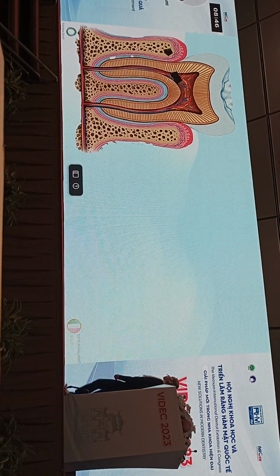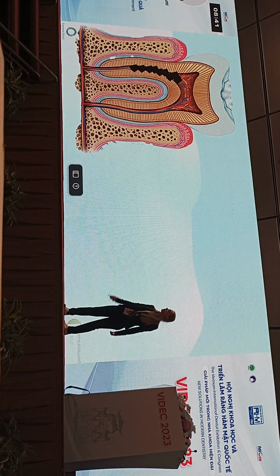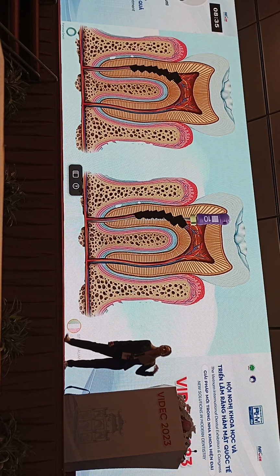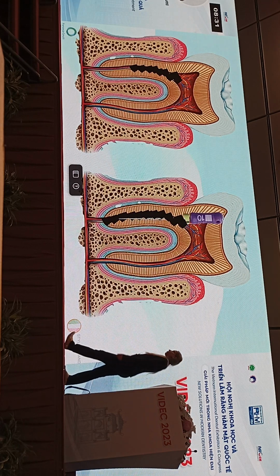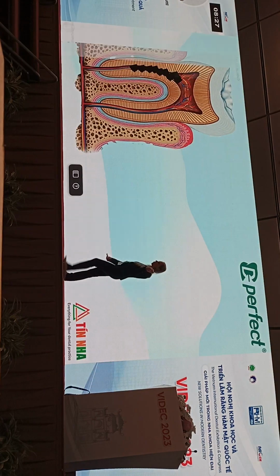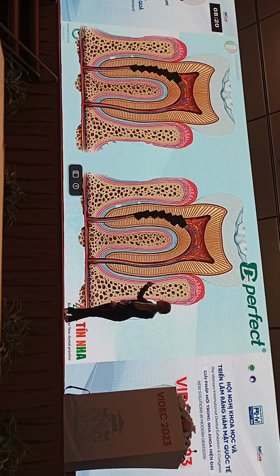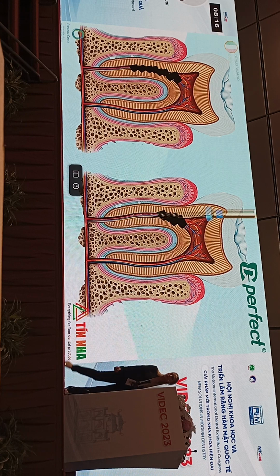Why? Because they were like this. If I have some debris, bacteria, pulp remnants in the root canal, and my manual file works like this, it's going to push the debris outside from the apical part of the tooth. This way. For their design and for their nature, rotaries go all in the opposite direction. And so we have the debris, and when our file rotates, they come outside from the coronal part.